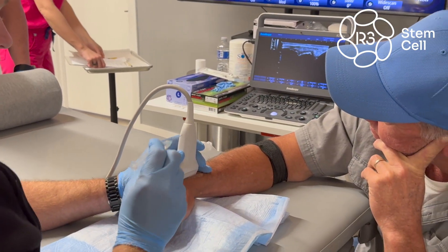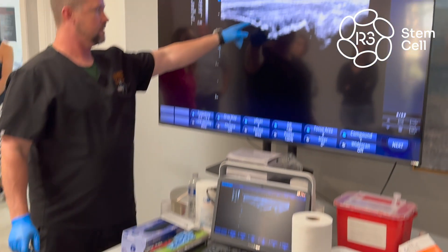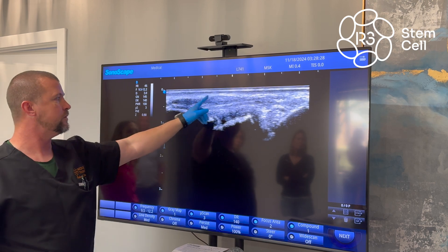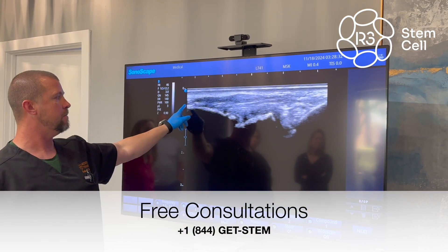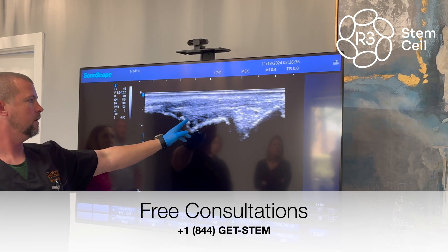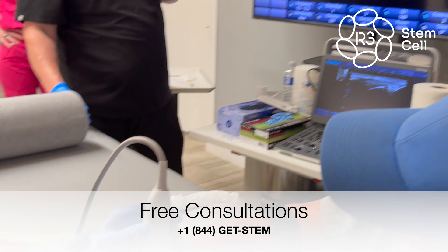It's going to go literally right underneath the probe. Remember this probe has distance — it's a two-inch probe, so a full two inches across. You have one and a half, so if I have to get all the way over here I'm not going to have enough. Come over just a little bit, come back — right there, you're going to be okay right there.